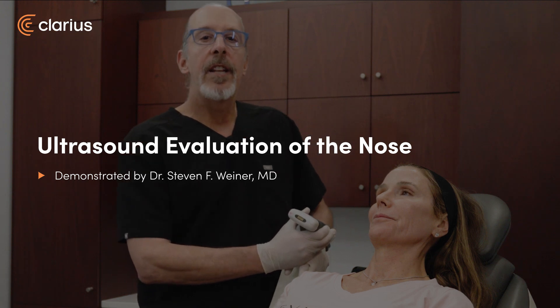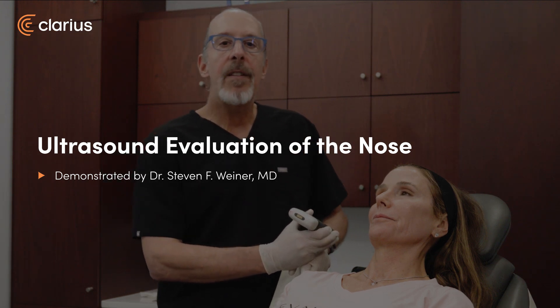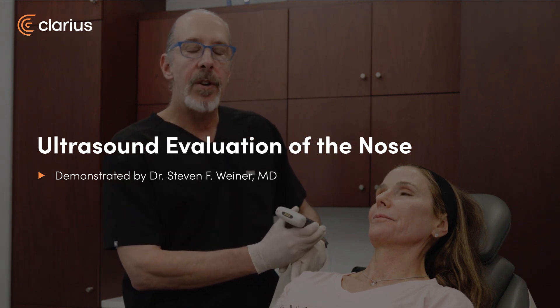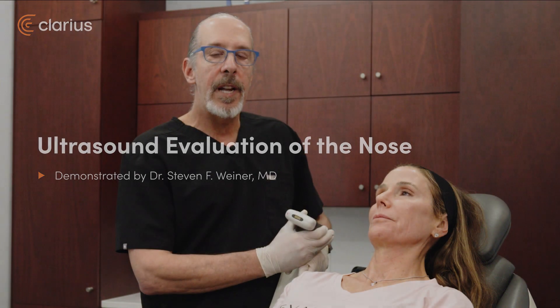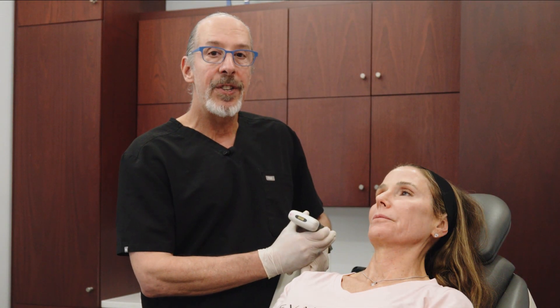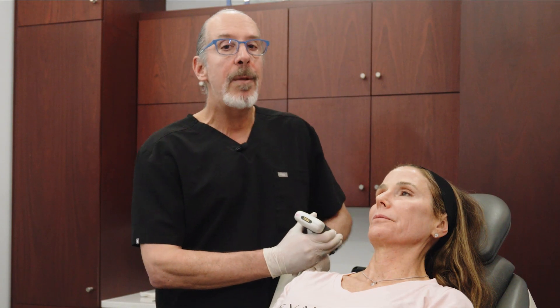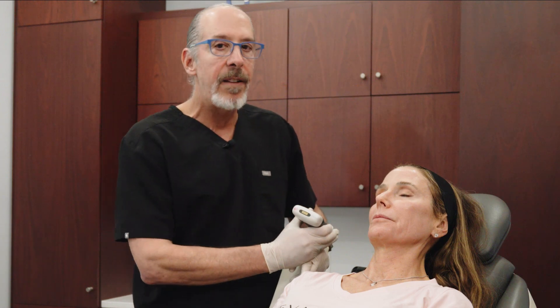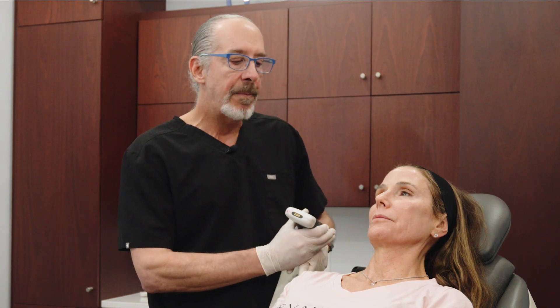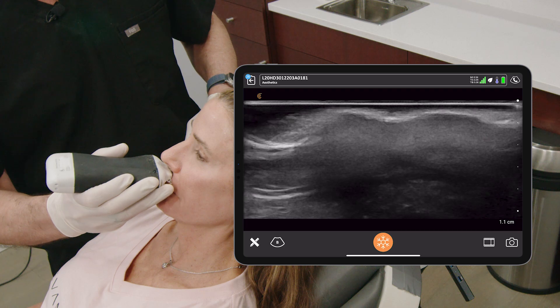Now, let's look at the nose. It's an area of high risk, so it's very important that you know the vascular anatomy before you inject. The vascular anatomy of the nose is highly variable. Let's start with the nasal spine, and that's right here.